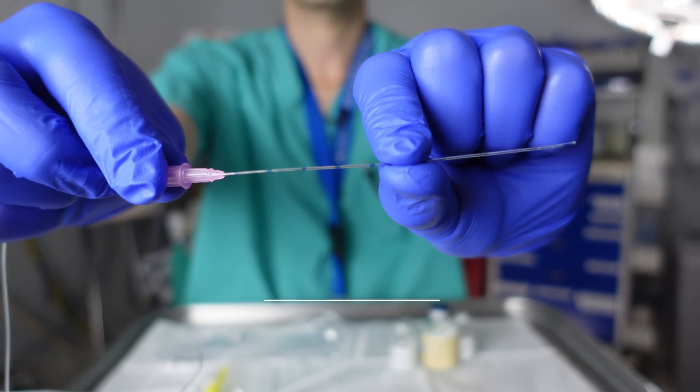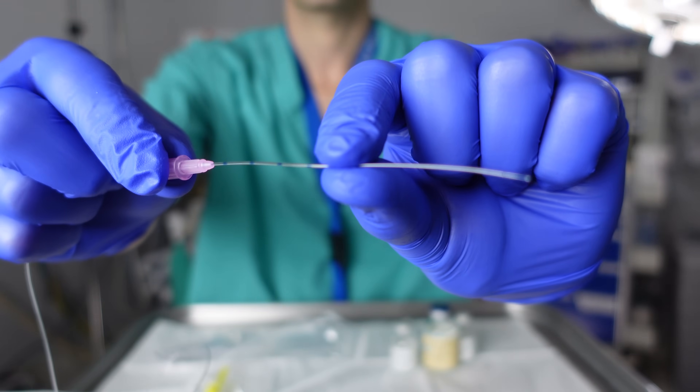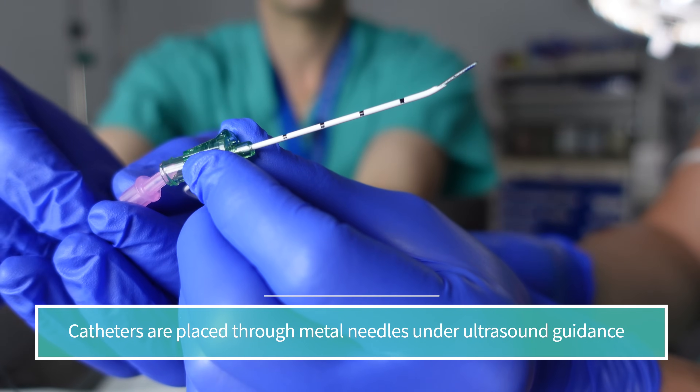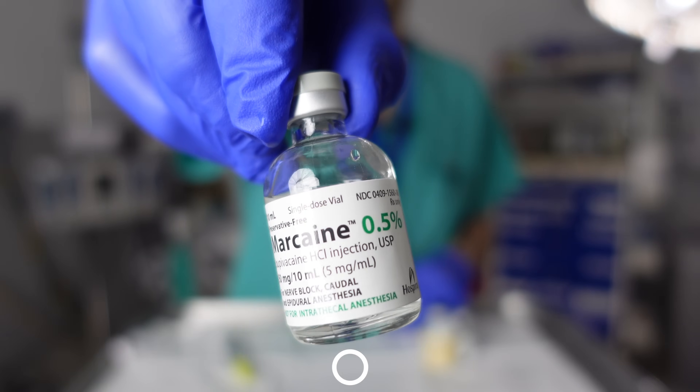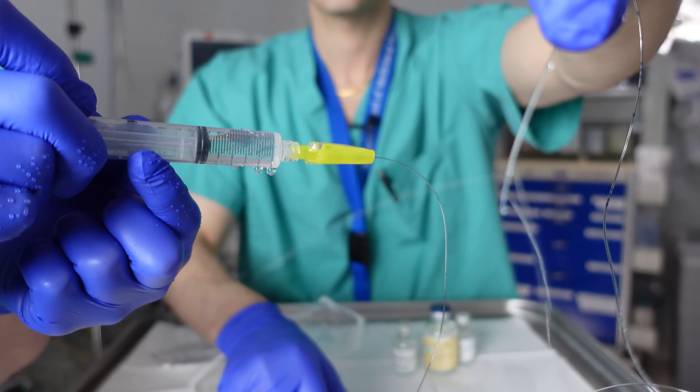So what's the benefit of having a catheter in place? The catheter is a great technique — it essentially allows the block to last for as long as the catheter is in place. If you do a single shot, you just inject numbing medication into an area of the body and it makes it numb for however long that medication lasts; when it runs out, it runs out. With a catheter, you can deliver medication continuously — there's usually an external delivery device and the numbing medication gets infused at a slow, continuous rate. We usually send patients home with a numbing medication device that lasts about three days, give or take, though it could potentially last even longer or shorter depending on patient preference. It's a great way to draw out the effectiveness of that numbing medication injection.